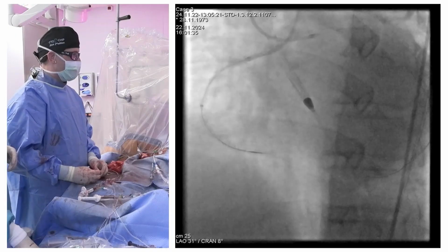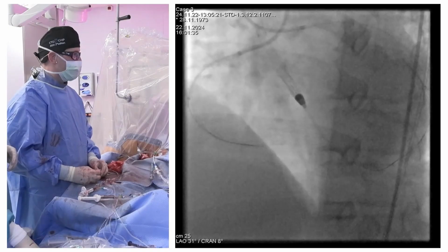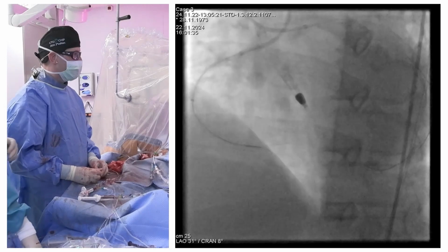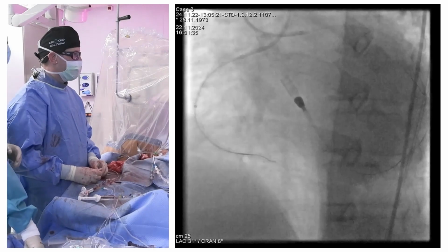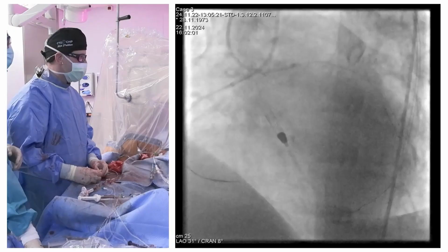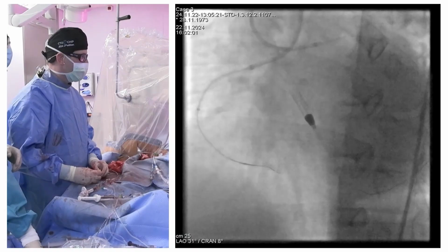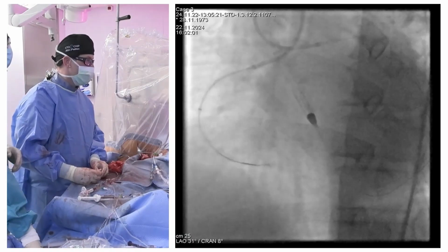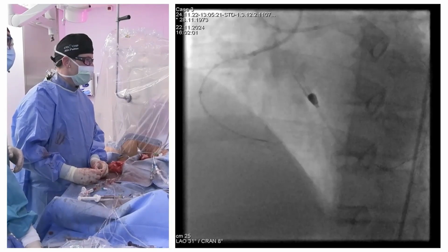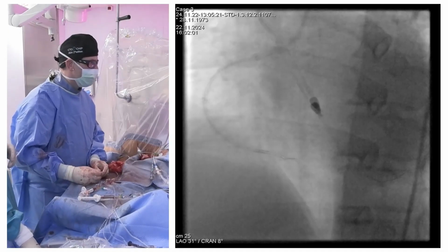Felix, may I ask about a very simple thing, and could you explain a bit about anticoagulation and antiaggregants during procedures like those? Because this is also an Impella, and this is a big sheath and everything, and you are doing quite nice, but also aggressive work. Do you think that we need some additional GP2b3a blockers for such long procedures and long lesions, or is it enough to use just what we regularly do, like prasugrel or ticagrelor or even clopidogrel and aspirin?